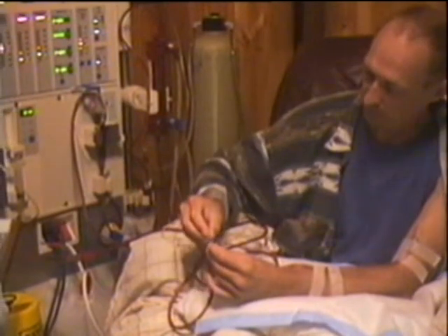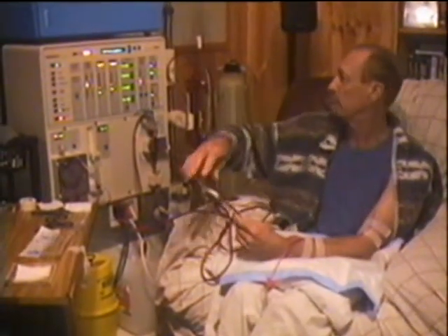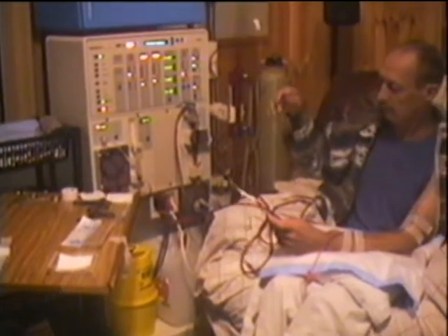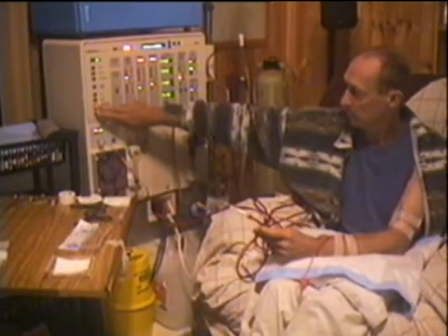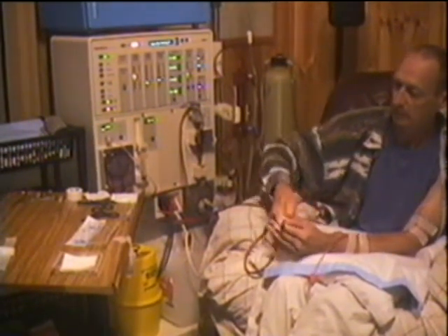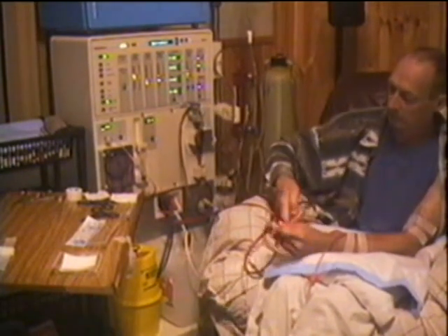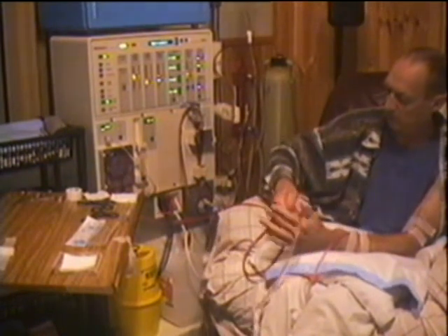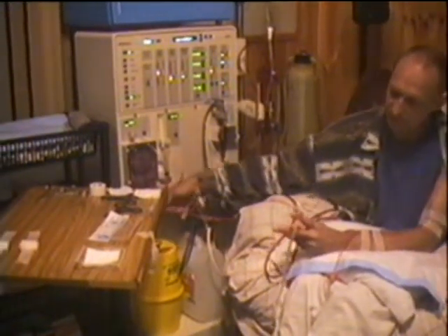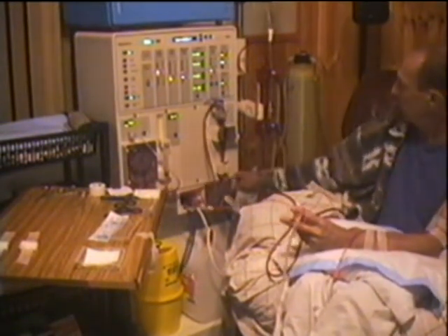Now I'll just put one of those little plugs on that — and that's ready to be pulled out later. Now we have to get all this blood out of this line, so I'll open this valve from the saline, which runs into there. We'll do normal dialysis at 180ml per minute, and you have to crimp the line because the blood tends to stick to the elastic tubing.